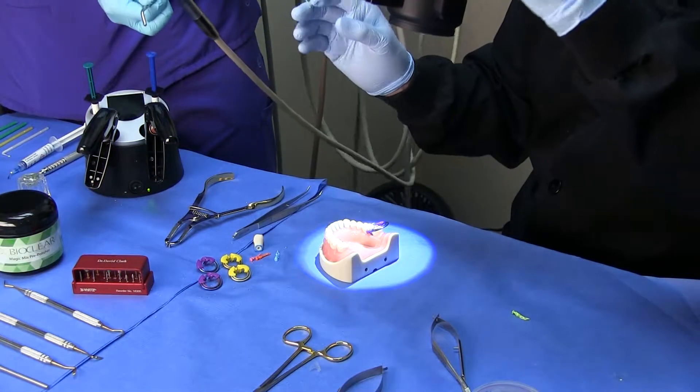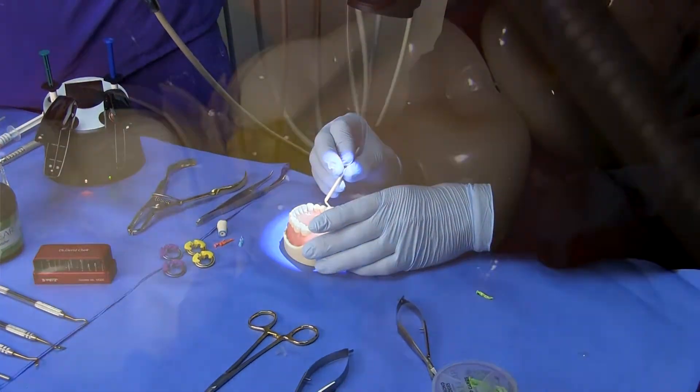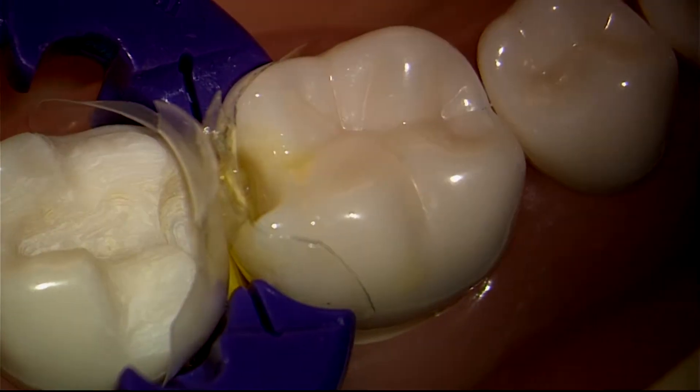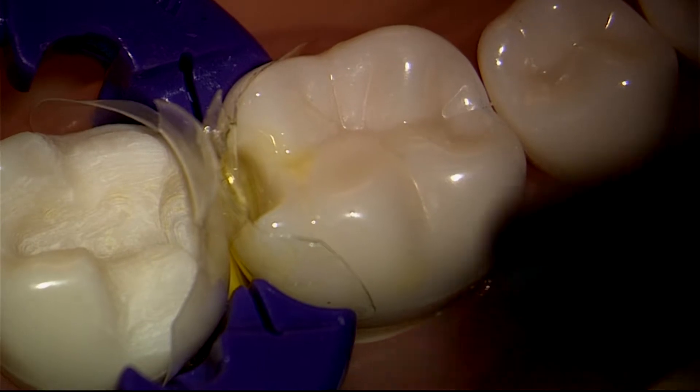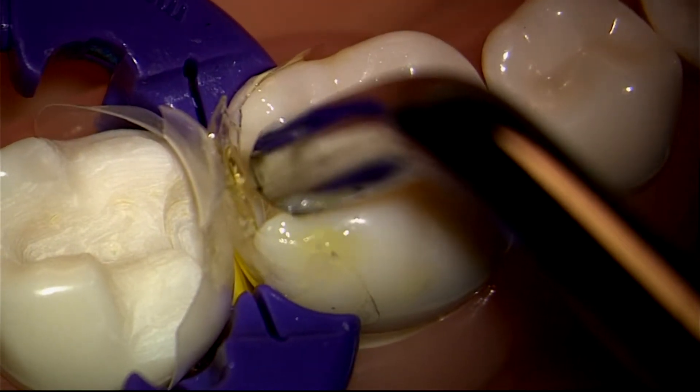I'm going to turn the filter off so you can see a little bit better depth with the flowable composite.